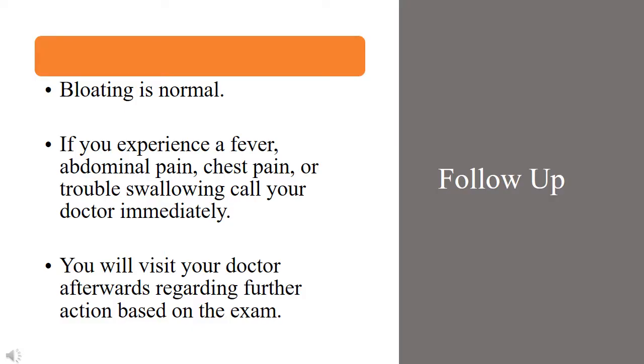Follow-up. Bloating, cramping, and a sore throat are common symptoms you may experience following endoscopy. You should contact your doctor if you experience nausea, discolored stools, or any other symptoms displayed on the screen. You should schedule an appointment with your doctor following the exam to discuss further action pending the results of your exam.